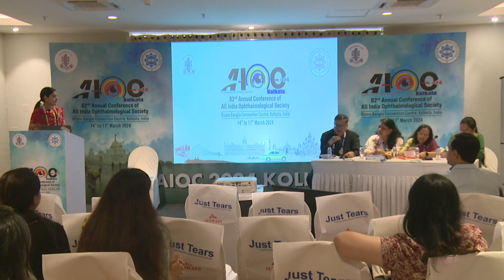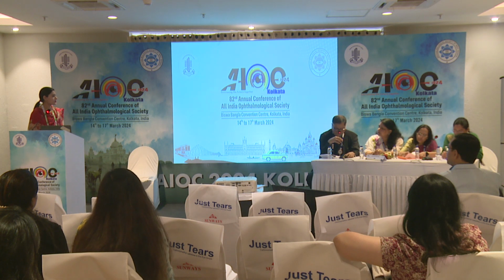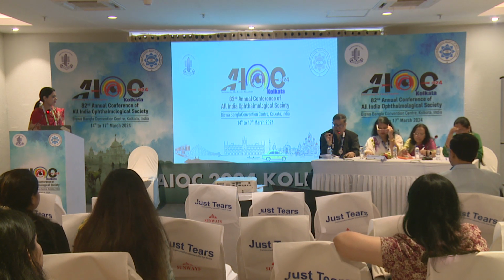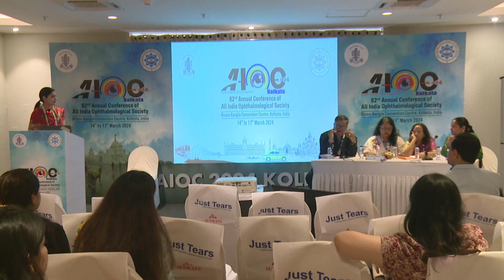You are not interested to see the CTR behavior? Sir, we did UBM for certain cases, like one of the slides that I showed. Post-operatively, whenever the patients would come at the scheduled visits, a UBM was done to see the centration and the placement. Now, your very topic dictates that all the cases should have the assessment of the position and functioning of the CTR in the long term, because you have used the long-term outcome of the ring. So it has to be assessed.